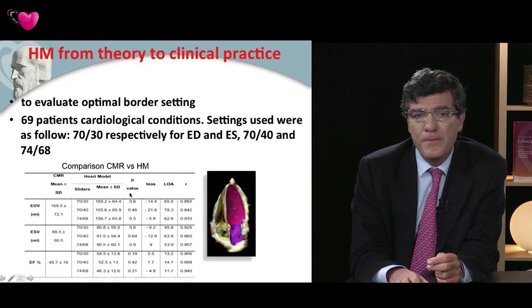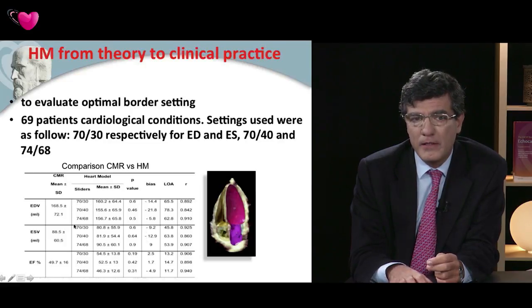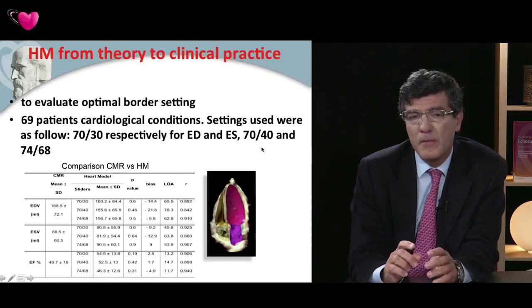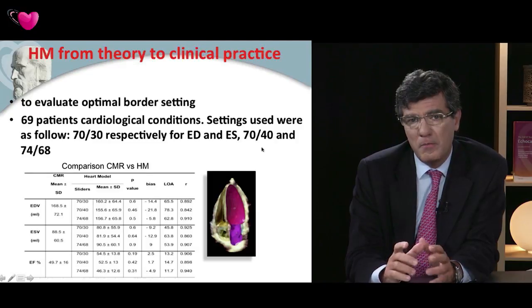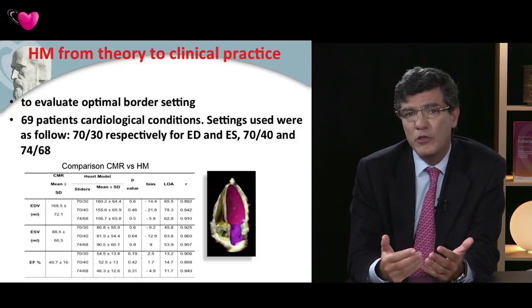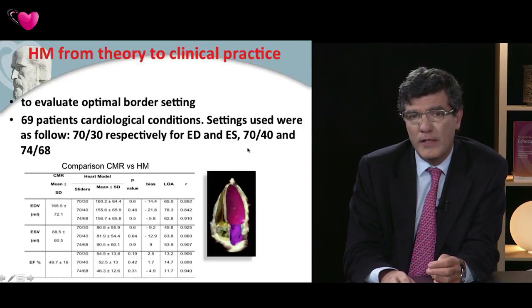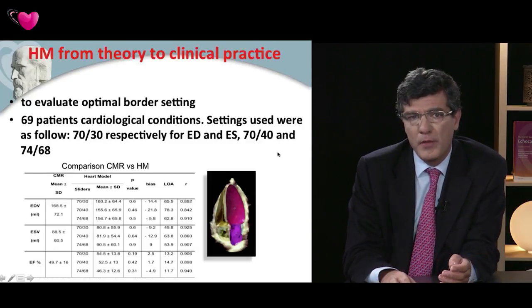And as you can see, even if some of the adjustments are more optimal, I think the message here is that for all the measurements, it works pretty well with all the adjustments. It's true that some are better than the others, but those minor corrections may improve your data, but it's only just to test, to see how it works better for you, and at the end of the day, all the different settings worked properly.